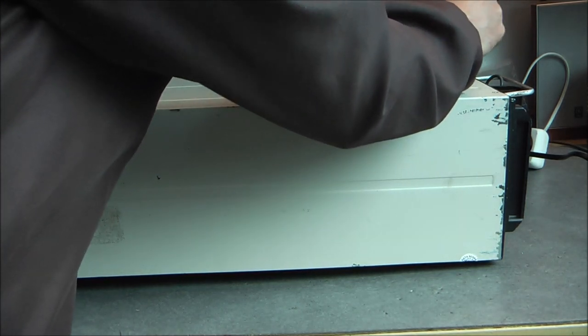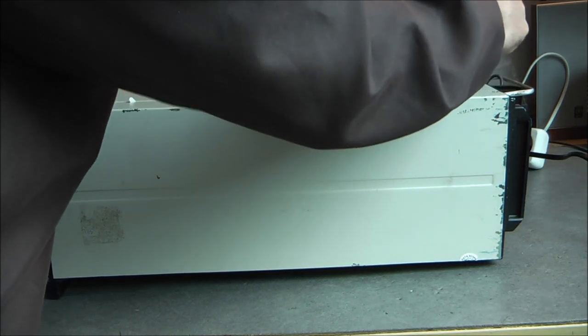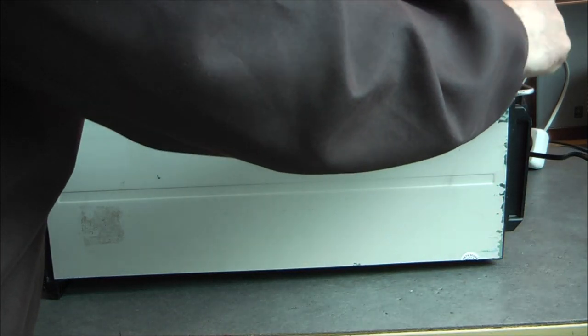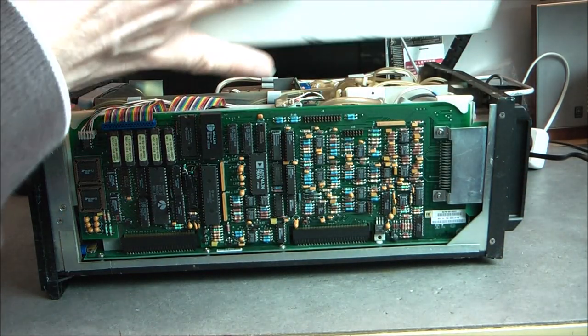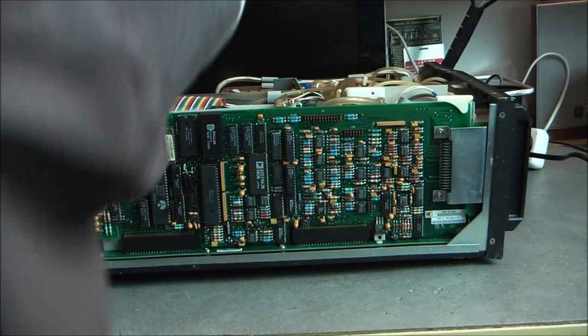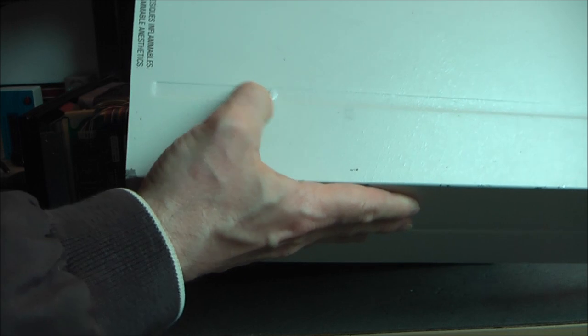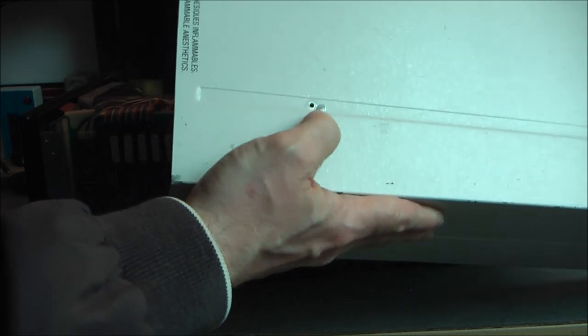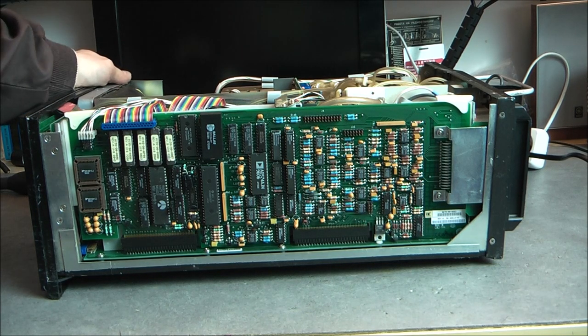It is really luck I was not intending to keep this device, and anyways it is going in parts. But it is a bad practice of my neighbors of packing stuff like this, in particular when it is heavy. So here is the cover off. We have provision for securing optional stuff in the cover with screw threads covered with little stickers. And now we have a first look inside.